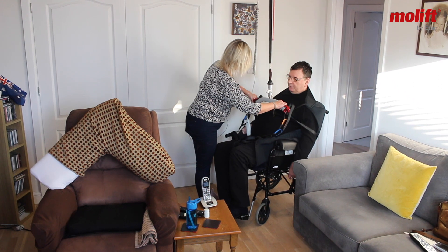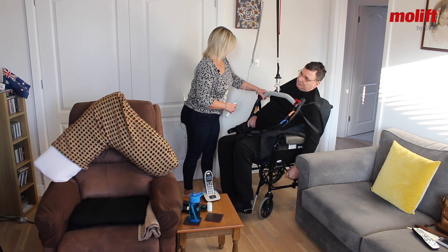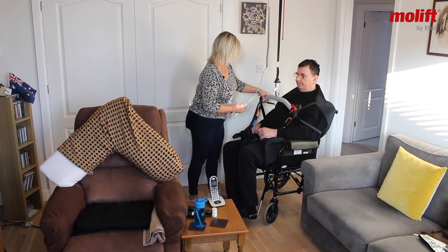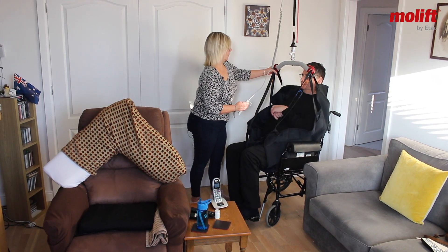I'm going to put the brake on the wheelchair so the wheelchair doesn't move. Okay, ready for this? Yep. Right, up we go.